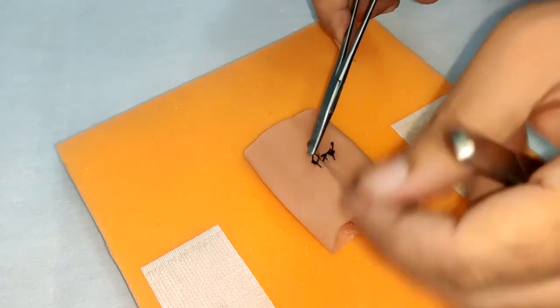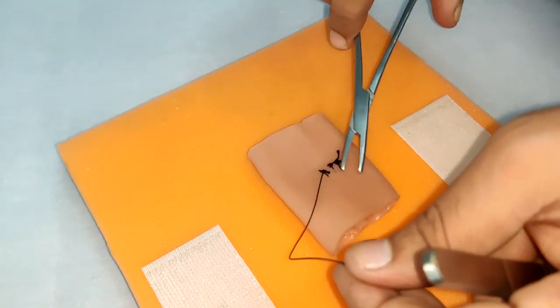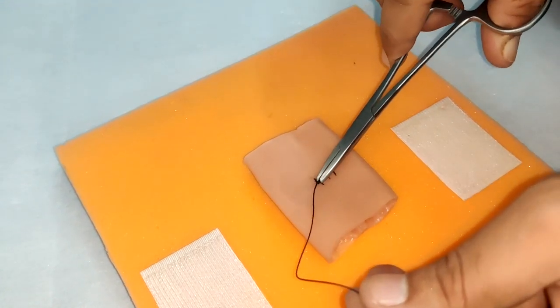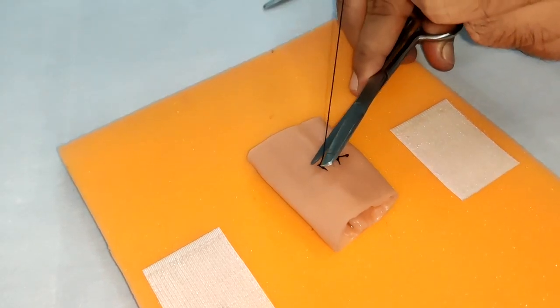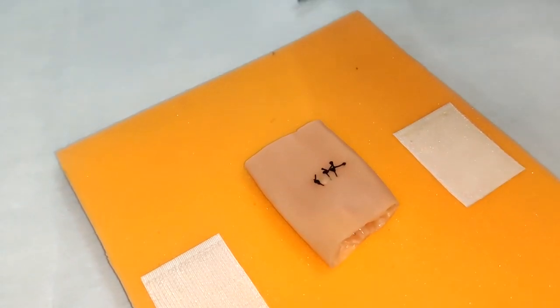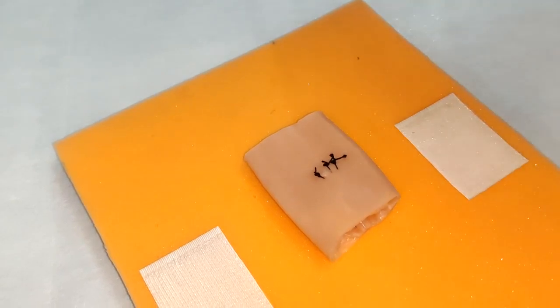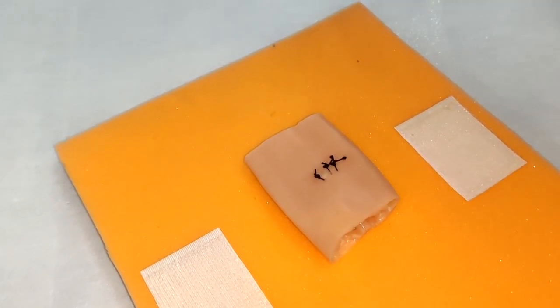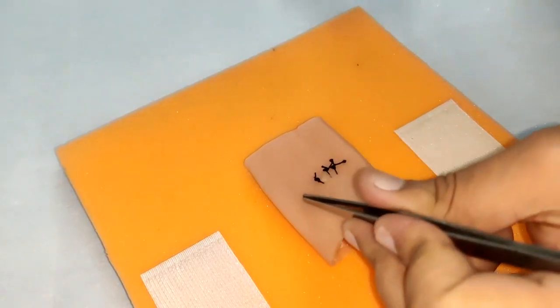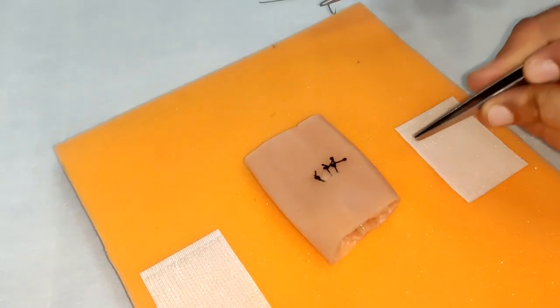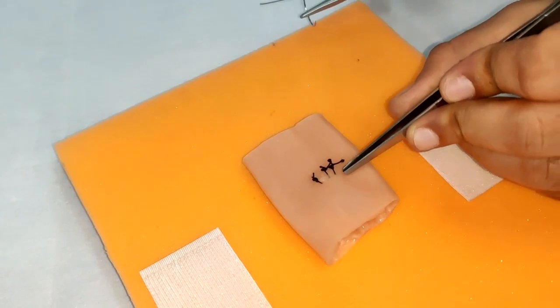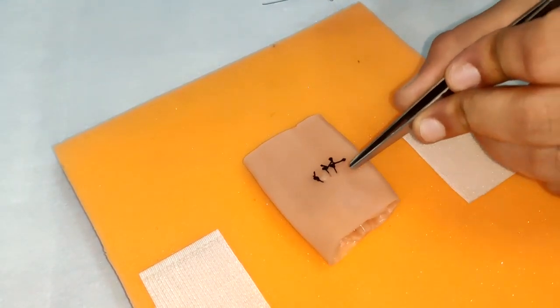Be it any intestinal perforation or gastric perforation, we have to always suture it perpendicular to the axis of the bowel. Another advantage is that there is less compromise of the blood supply because the blood supply will come from the mesentery and will traverse perpendicular to the axis.